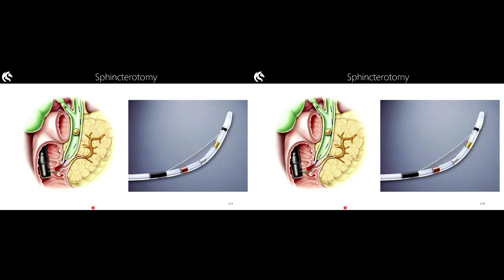Stones can have different density. They might be a rock, or they might be muddy sludge. And indeed, when you do see an ERCP, when you see a stone actually being removed, don't be at all surprised that they do have quite a variable density to them. So, how do we get an 8mm rock out of a 2mm hole? The answer is make the hole bigger.